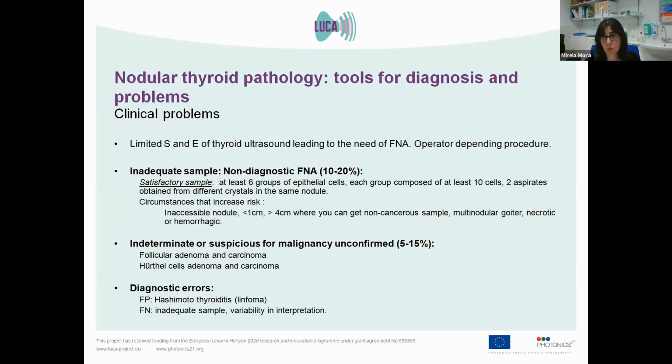We have also taken into account that the ultrasound, as you know, is an operator-dependent procedure, so it depends on the experience and the ability of the radiologist and endocrinologist that is performing this ultrasound exam. And also we have the limitations that we have commented before in relation to the fine needle aspiration.